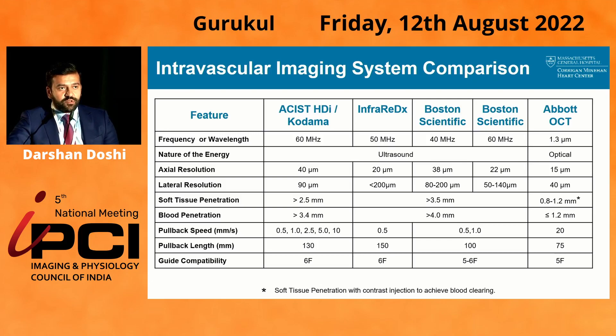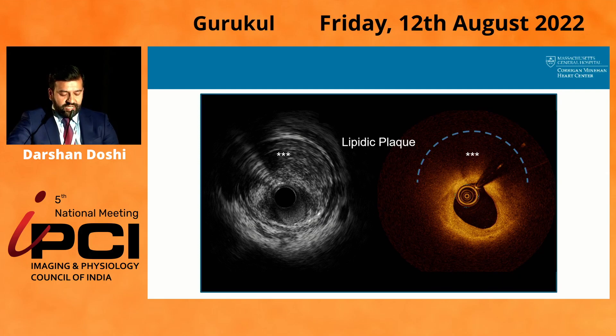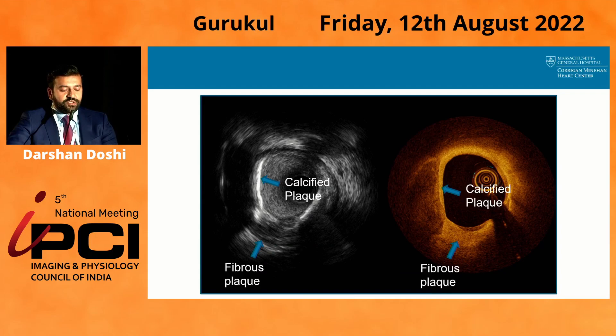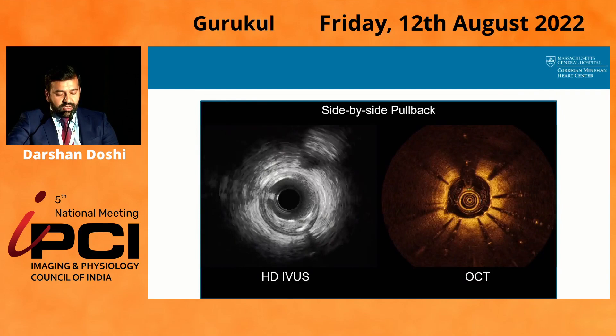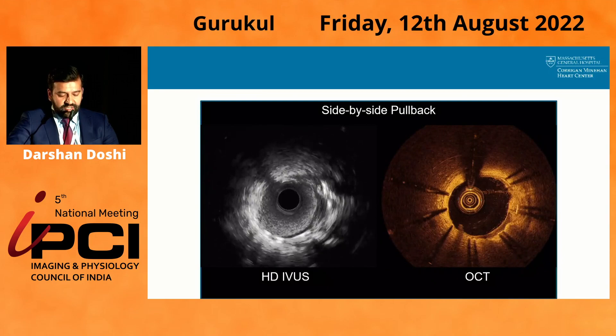These high-definition systems give you near-OCT resolution — they've gotten that good. Looking at lipidic plaque, the high-definition IVUS gives results very comparable to OCT. For a combination of fibrocalcific plaque, you can distinguish the fibrous and calcific components with HD IVUS in a way comparable to OCT. And on a full pullback, you can see from side to side that you have near-OCT resolution and quality with higher-definition IVUS.